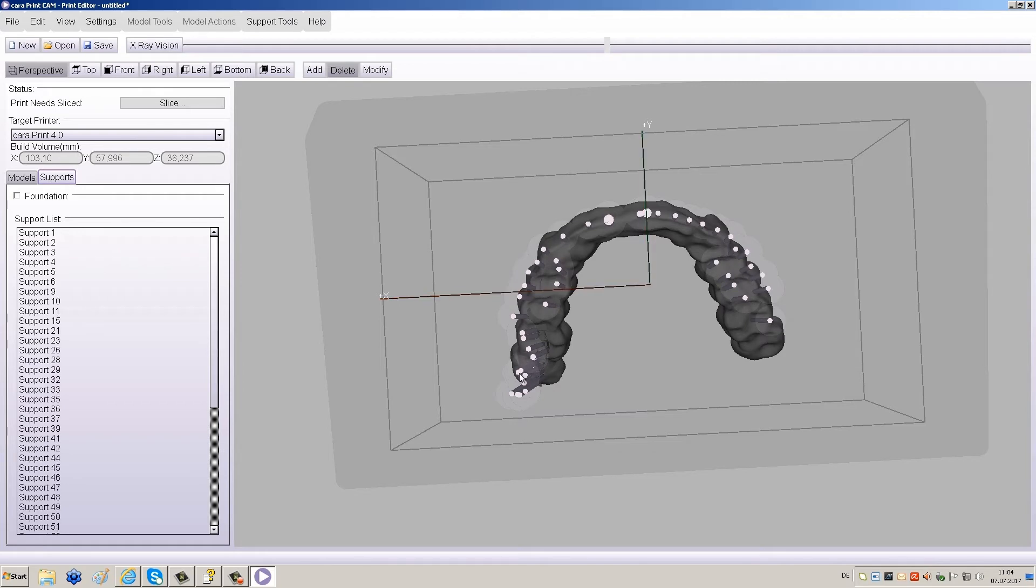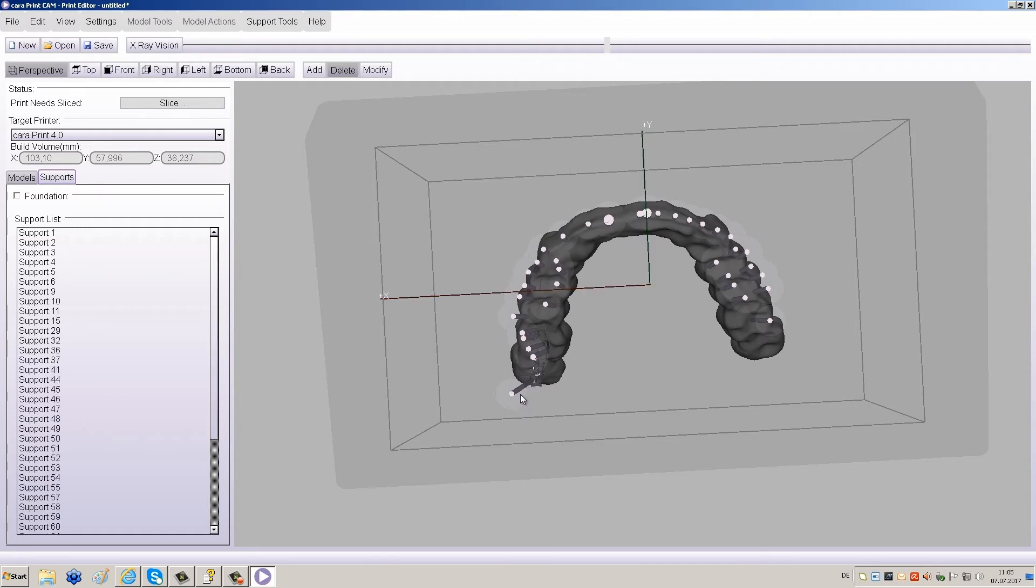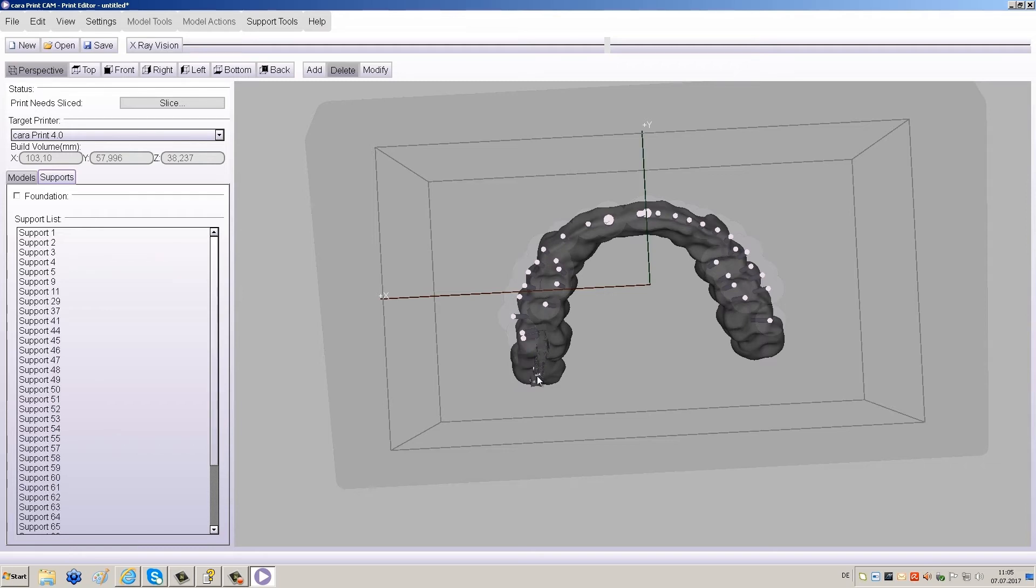Add thicker supports to replace the ones you deleted. Depending on the angle of the object, terminal parts of the splint will need to be supplied with thicker supports, especially in the back molar region. Remember, longer supports are less stable and could break while printing if they are too thin.